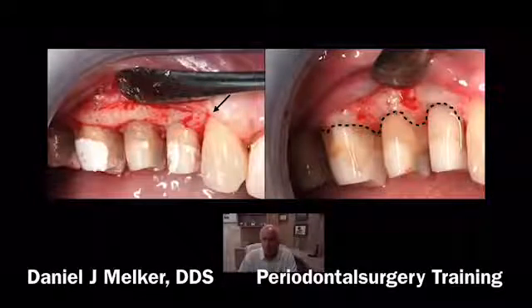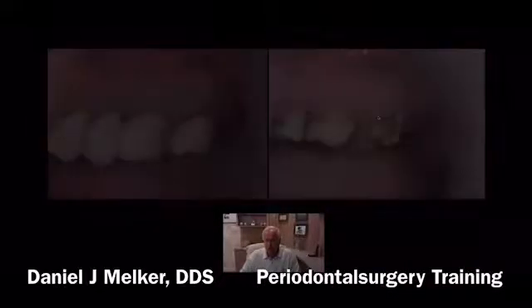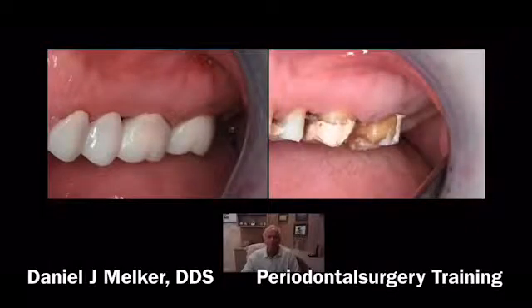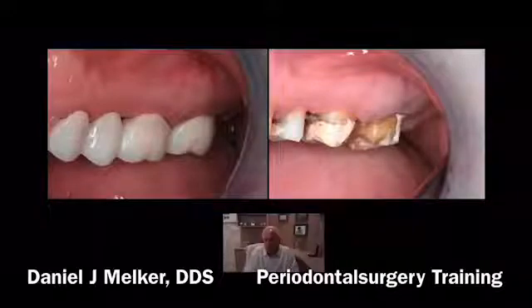The bone and tissue are mimicking each other — it's going to be a perfect relationship. No margin is located on any tooth anywhere when we are finished with biologic shaping, which we're hours away from. We're doing this case together, and all my cases must have cores where needed and provisionals. I have to have provisionals — I can't treat an old crown. That's my opinion.